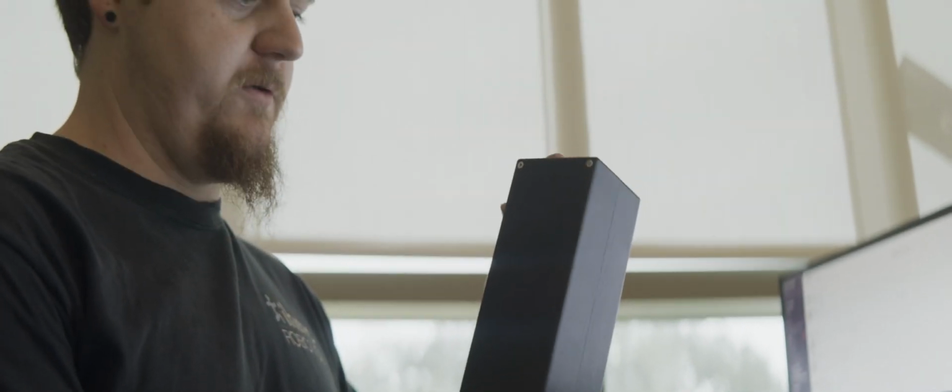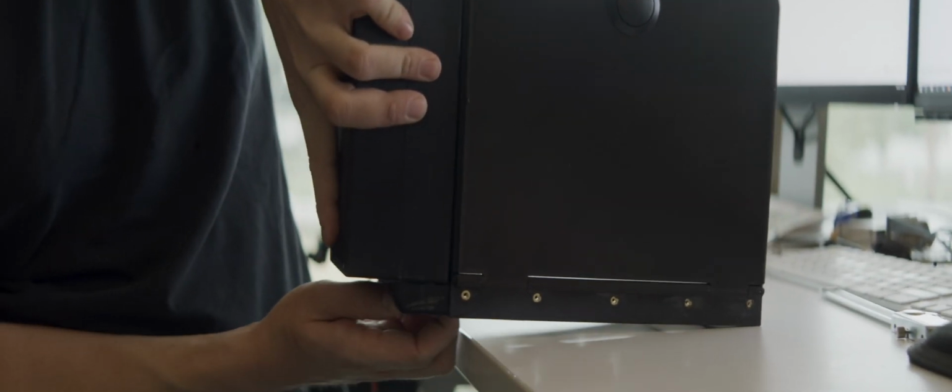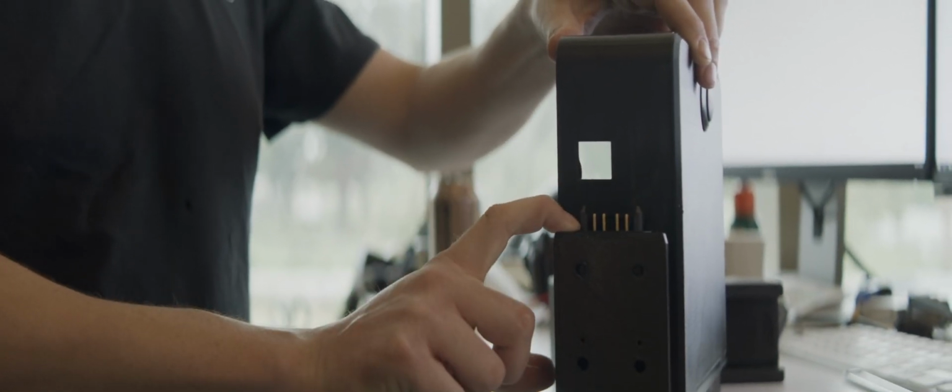The battery pack is very similar to just a cordless drill. You slide it on. And it just locks in place. To release it, there's a button here. Grab it and pull up. And it comes off. Here on the battery pack mount, there's a contact protector to make sure you can't get your fingers in there.